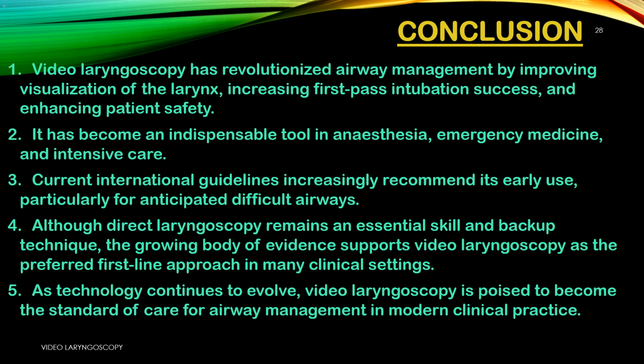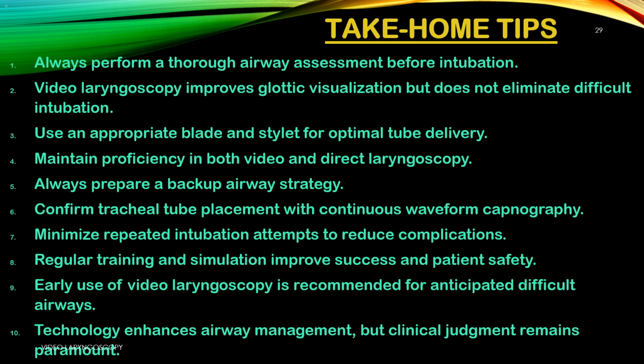5. As technology continues to evolve, video laryngoscopy is poised to become the standard of care for airway management in modern clinical practice. With AI, portable devices, and better design, it will likely be the default tool for intubation going forward. Take-home tips. 1. Always perform a thorough airway assessment before intubation. Check mouth opening, neck movement, and airway anatomy first. Helps predict if it will be difficult.